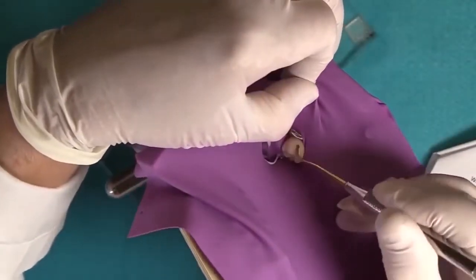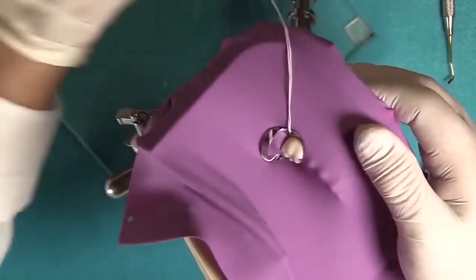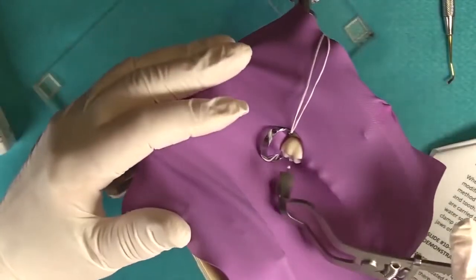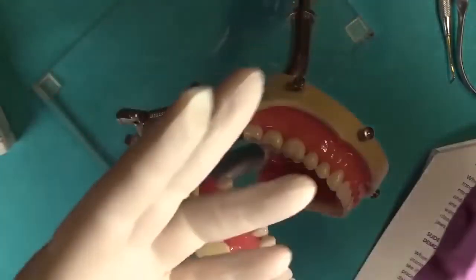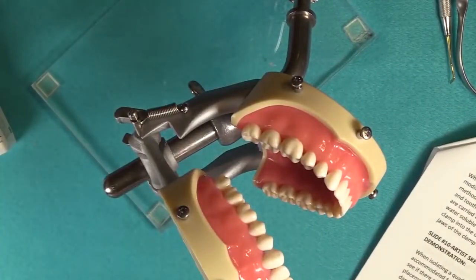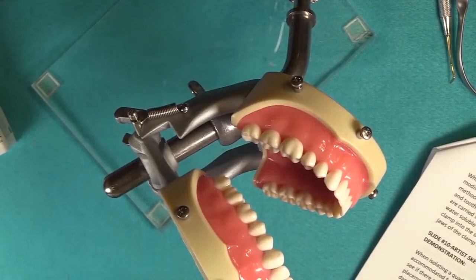out, all you have to do is get your instrument here. You see why you want it threaded from the bottom to the top, and then again you can go ahead and release the corner and just secure it into position. And then to remove your clamp, again, simply engage the forceps into the holes and squeeze, take off the clamp, and the dam and frame come off together. So with the wingless, it doesn't all come off at the same time. No, you always take the clamp off first, and then the dam and frame come off together. That goes for whether winged or wingless.